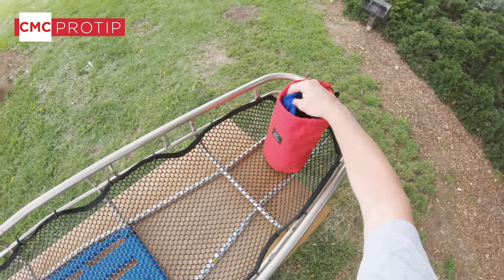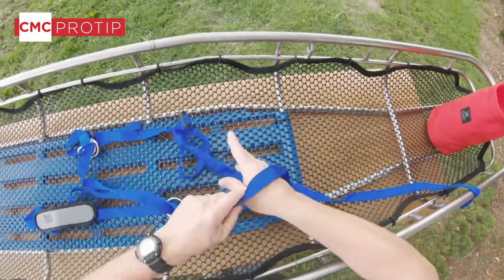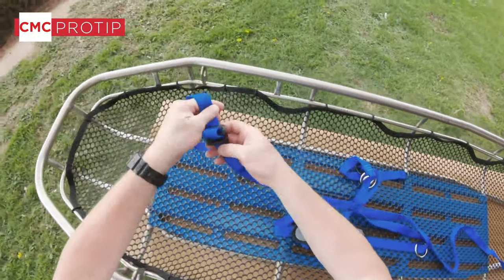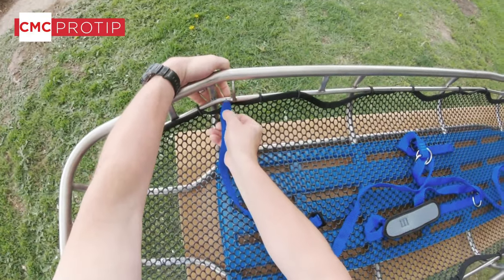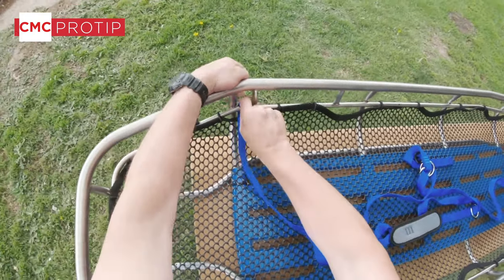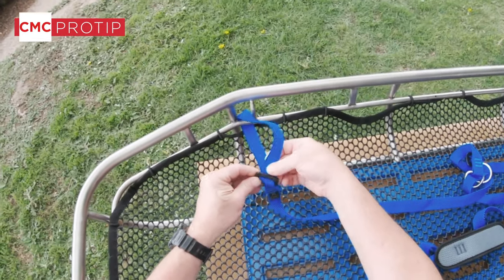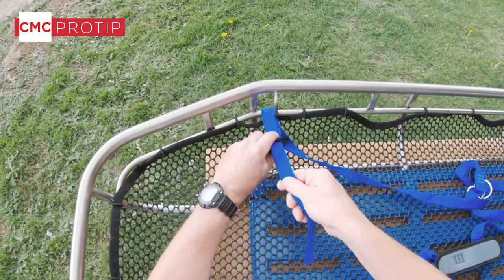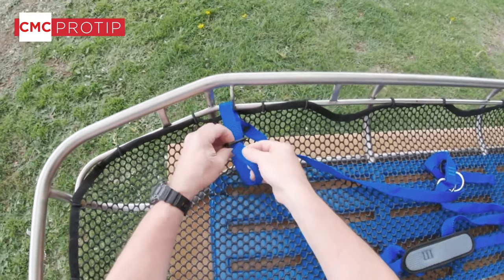We're going to start out with one of the side straps here and lay it out. We start by putting the strap at the head end. You can see we're going into a pocket so it can't slide. We trace through the buckle and trace back through it so it's secure.